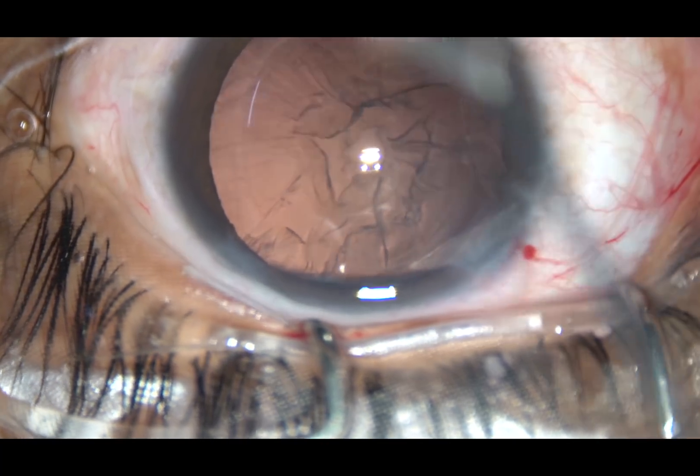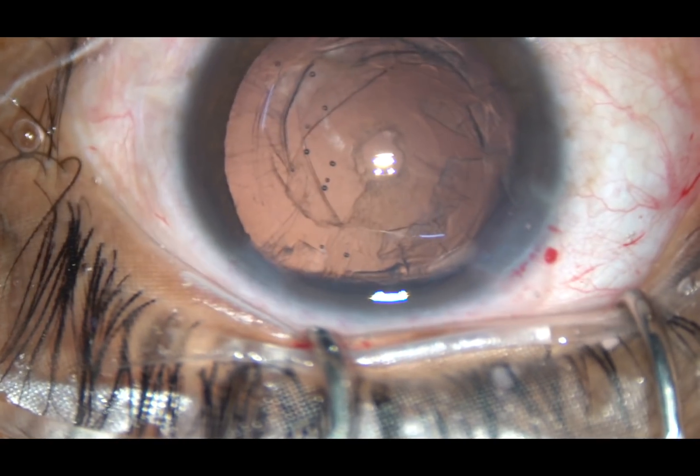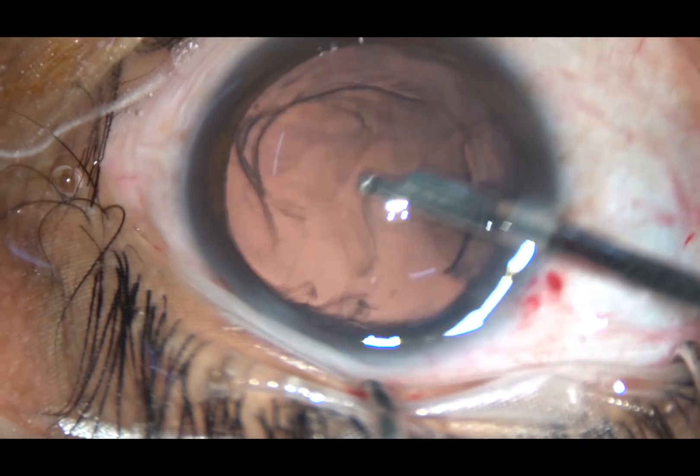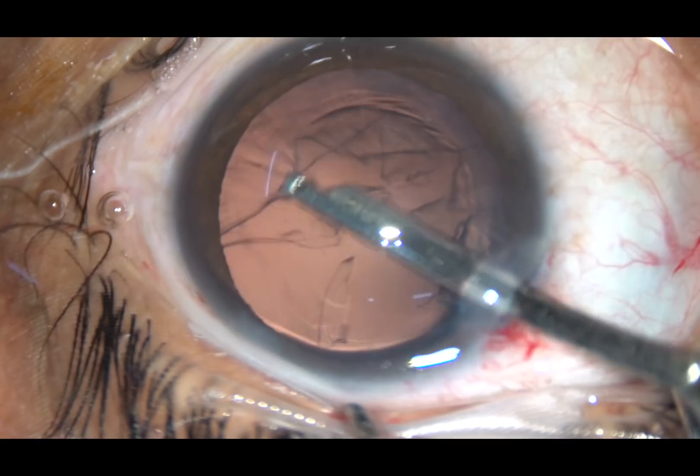Viscoelastic substance is injected into the anterior chamber, and now see how easily you can remove the cortex with this very simple instrument. You need only one side port for this.